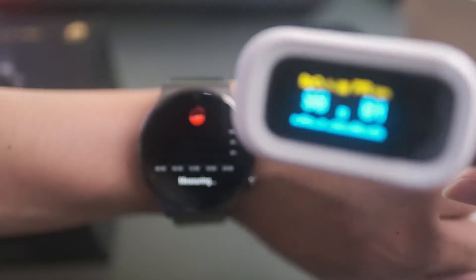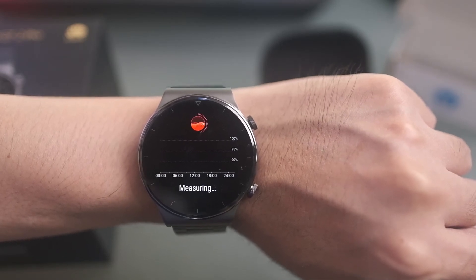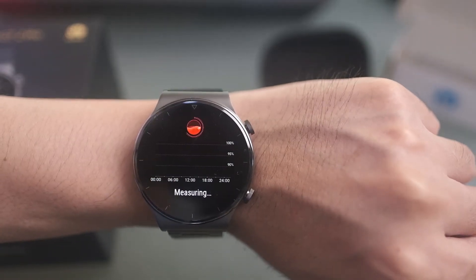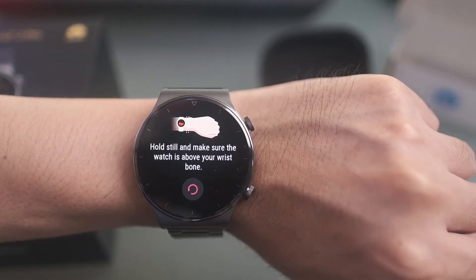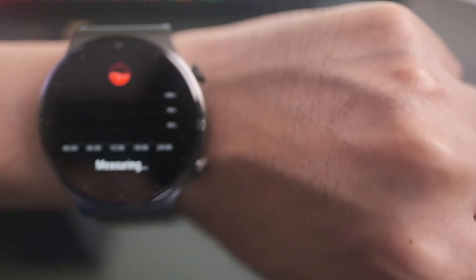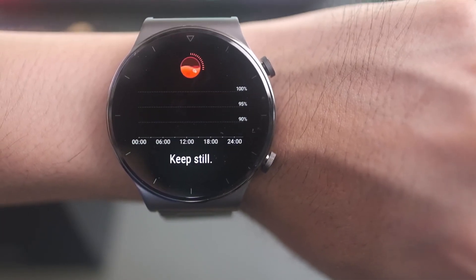The pulse oximeter still shows 98%. This is a disadvantage of the Huawei GT2 Pro — it's not real-time, unlike Samsung or the Apple Watch. You have to press measure and wait about a minute while staying as steady as possible. There was an error: it says 'hold still and make sure the watch is above the wrist bone.' I'm trying to stay steady. The pulse oximeter still reads 98%.